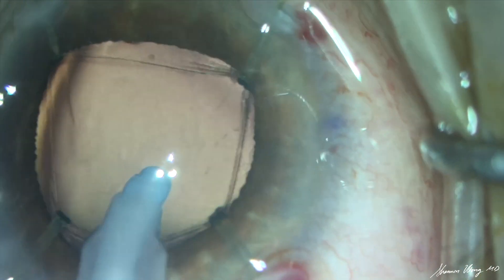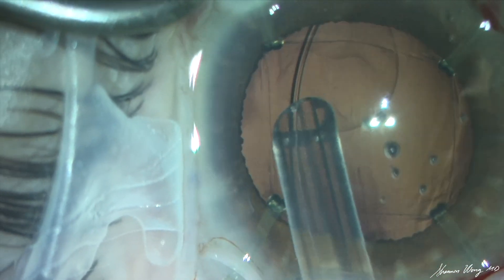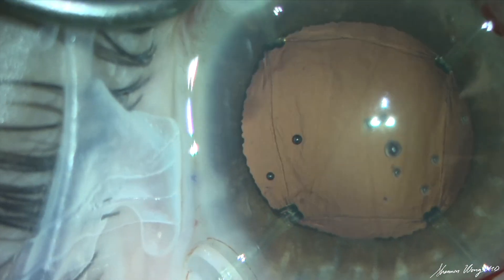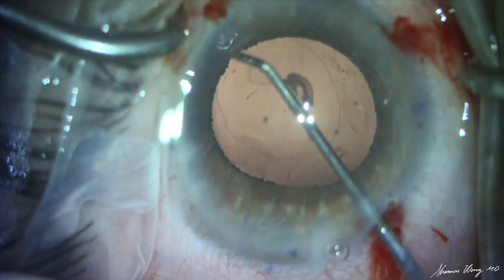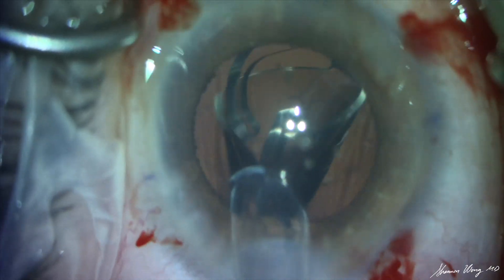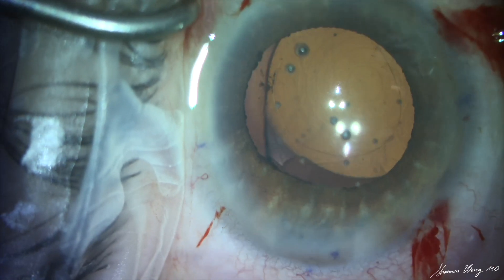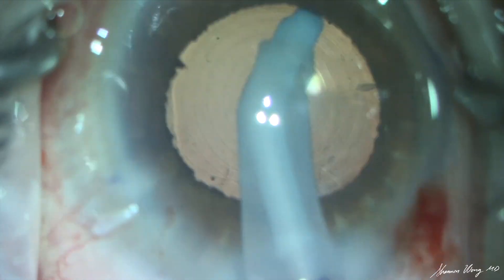Once the cortex has been removed and the posterior capsule polished, a capsular tension ring is inserted to provide more stability for the capsular bag. The capsular retractors are then removed, the posterior surface of the anterior capsule is polished, and the PanOptix lens is gently inserted into the capsular bag.